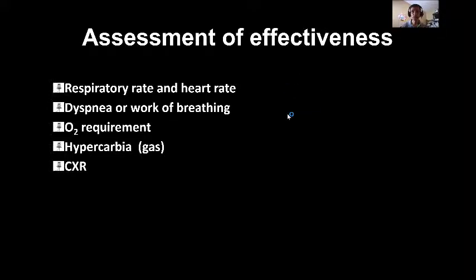15 centimeters of water. I mean centimeters of water. 15 is the level of the CPAP. You can reach CPAP up to 15. You start with 5 and increase. You can reach up to 15. After 15, you will not get benefit, because no matter what you do, you will have reached the maximum contact between the distended alveoli and the capillaries. Below 15, you get less contact.